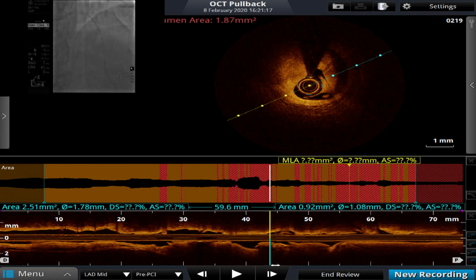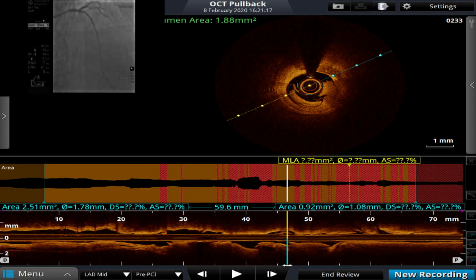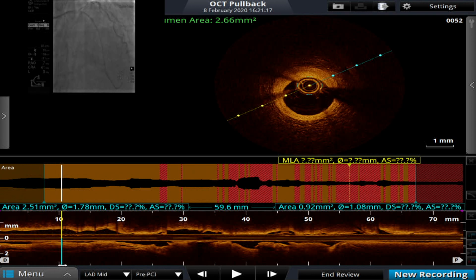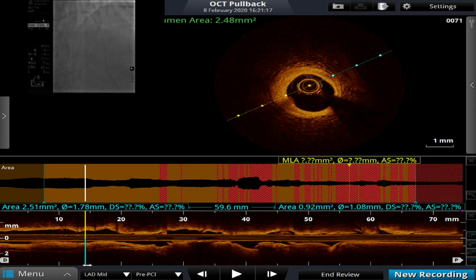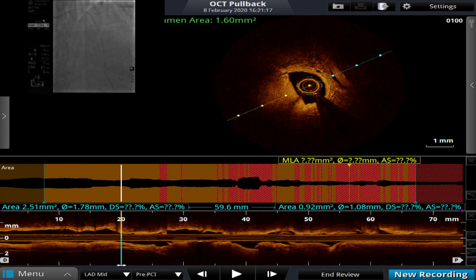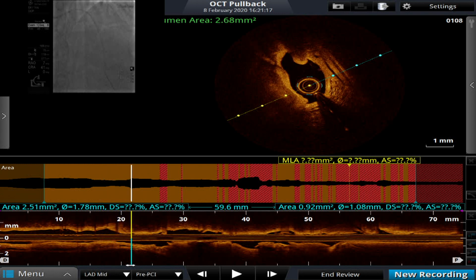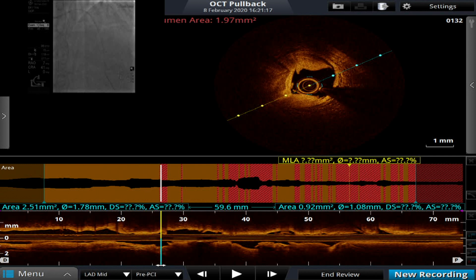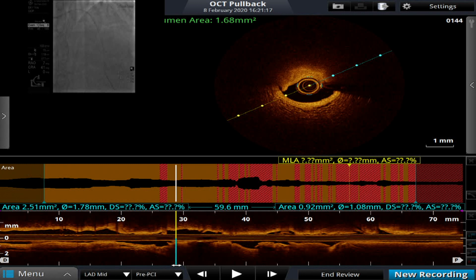So if you see from where, yeah, from that is whirling. Distal looks pretty good. There is some calcium, some fibrosis, and here is the calcium from almost 6 o'clock up to 11 o'clock position, and you see another area of calcium, particularly regional area there.